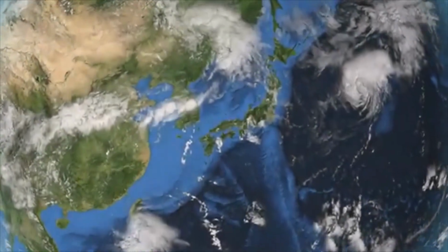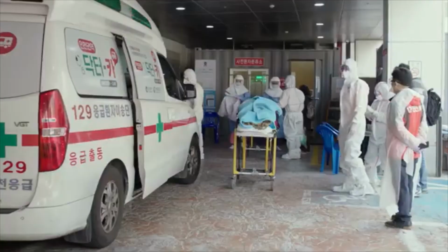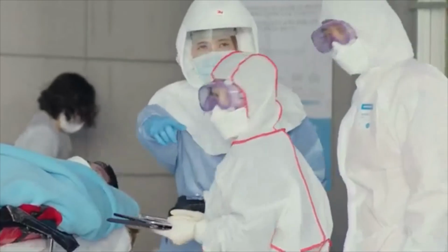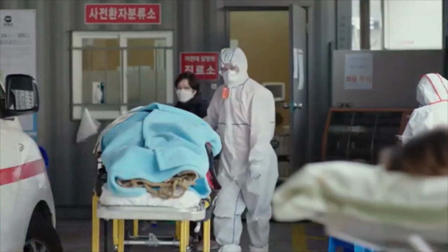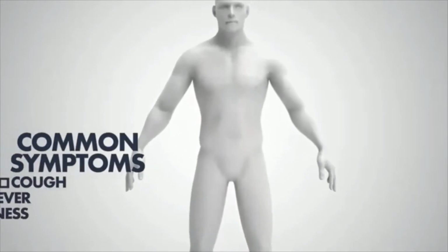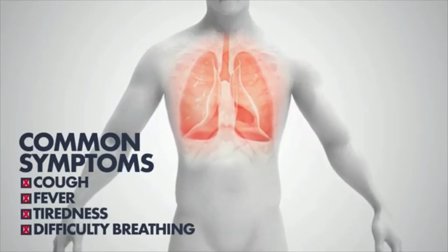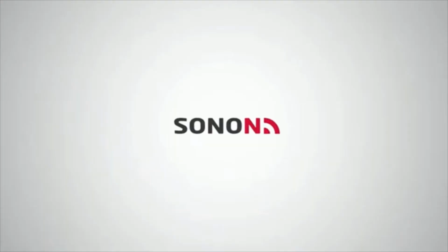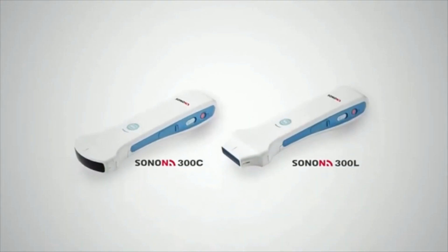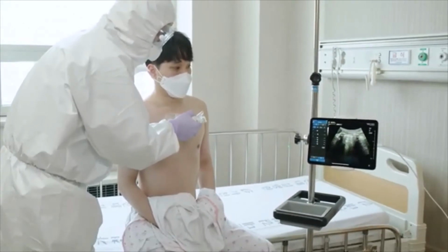South Korea's pandemic response system and medical equipment together have produced a cutting-edge front in the fight against COVID-19. Across the country, rapidly multiplying screening centers have helped flatten the curve of the virus. An important challenge has been identifying patients who develop pneumonia without displaying any apparent symptoms. With many such patients, Sonon, a mobile ultrasound device, has been used to measure the severity of pneumonia. This information remains crucial in determining the need for hospitalization.